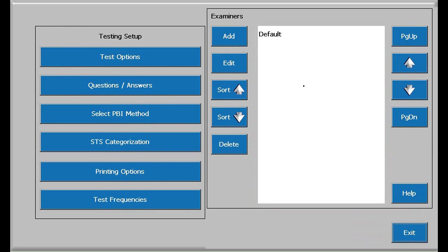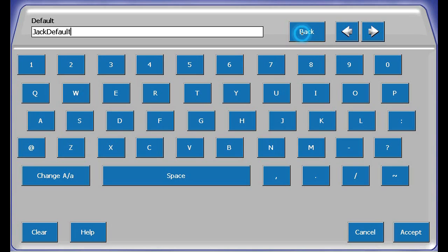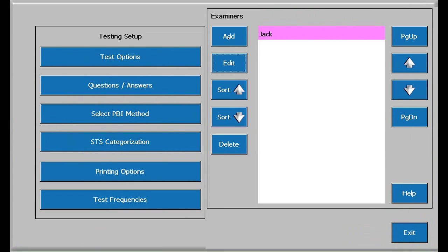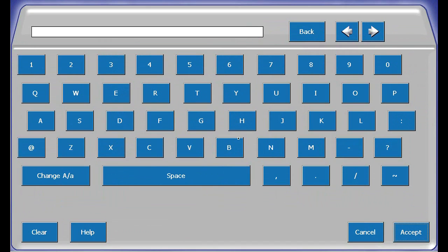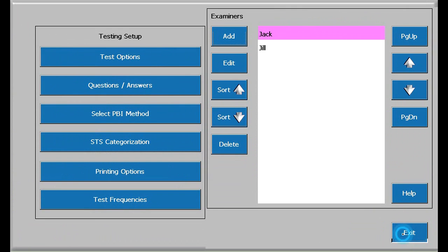The examiner setup is a similar process to our previous Q&A answer entry. Highlight and edit the default entry and add as many additional examiners as you need. Forgot to get rid of the default, I'm going to back that out, put in J again, and accept. Now I'll add one more, and accept, and then exit.